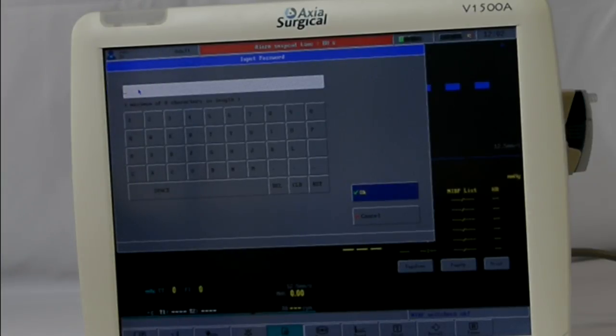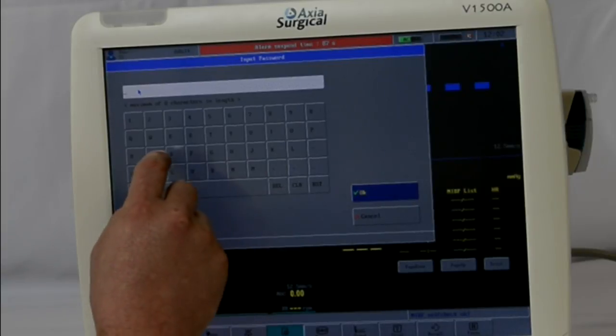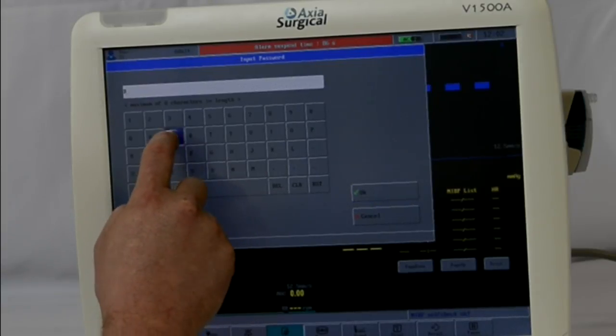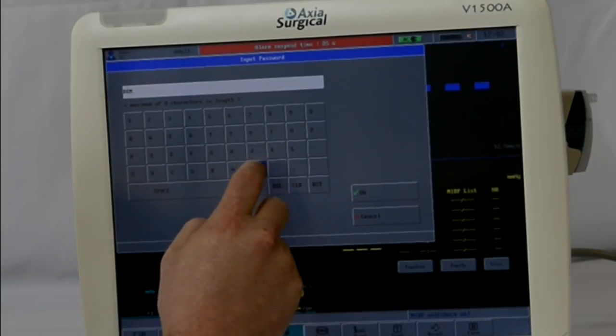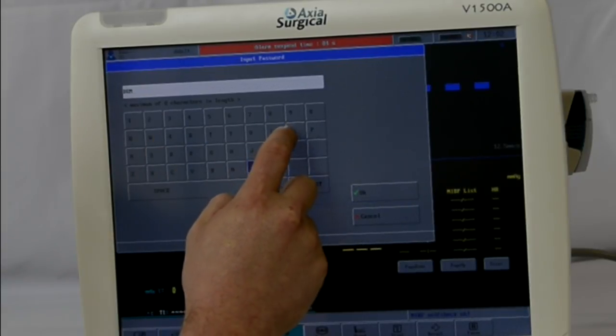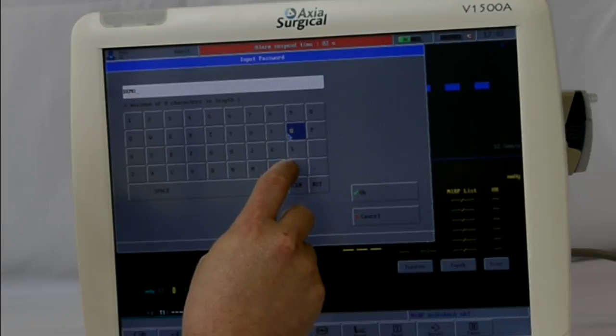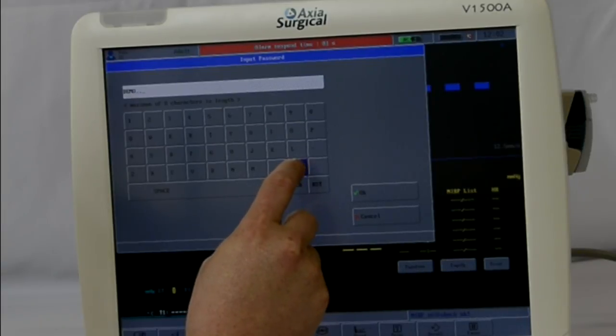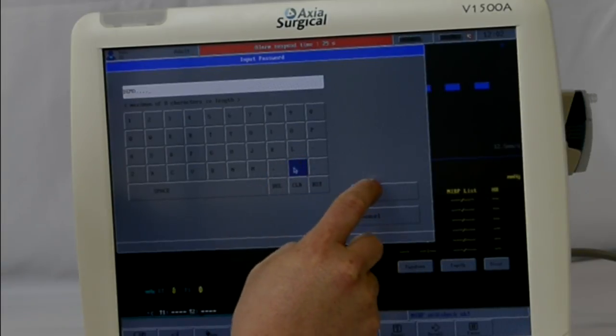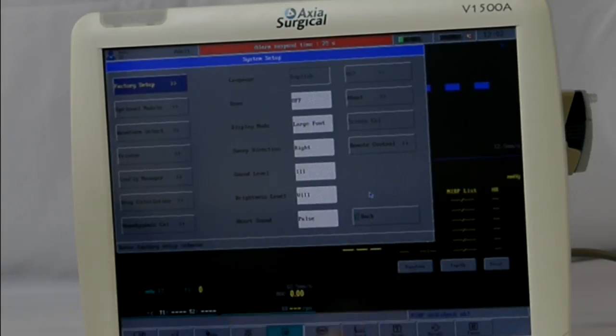The password is DEMO — D-E-M-O — and then four periods: one, two, three, four. Then hit OK.